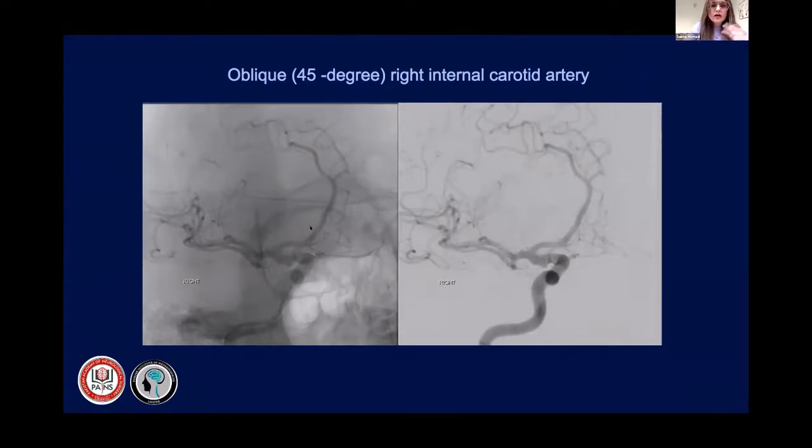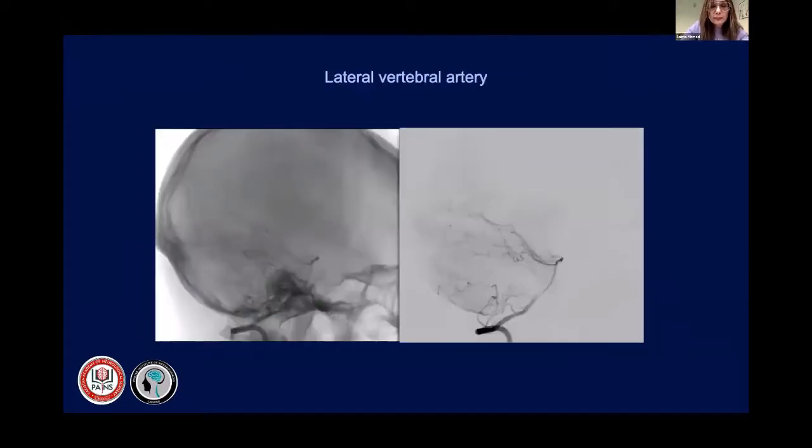So we can incline the tube at any angle you want. If you want to open the vessels, you can move it more. Sometimes you cannot see the aneurysm, then you ask them to make the angle wider. You can make it wide. It depends upon the pathology you want to see.